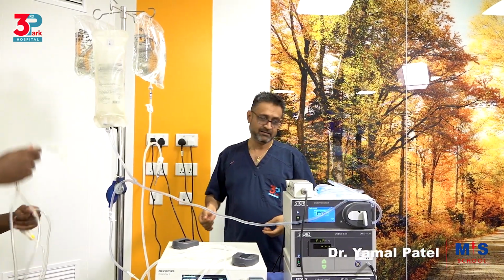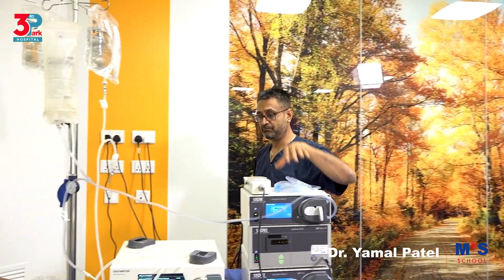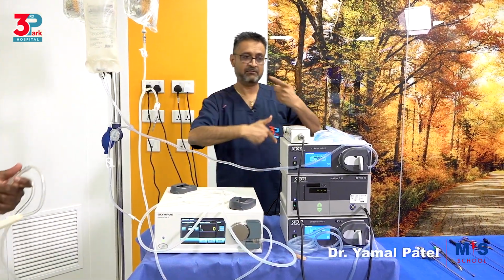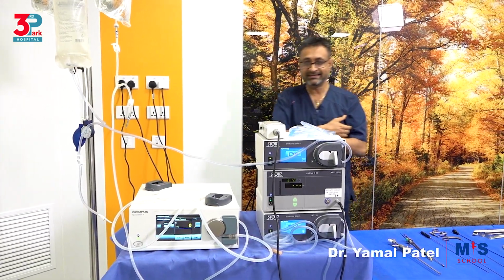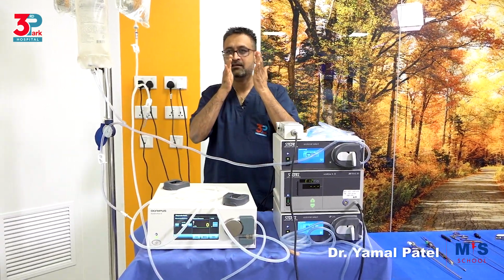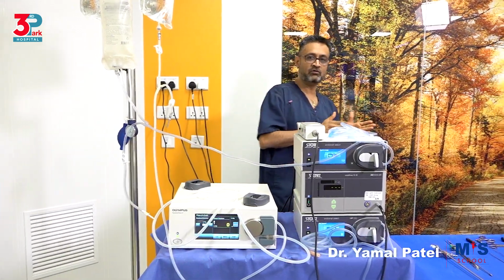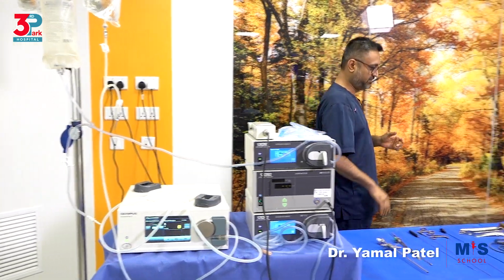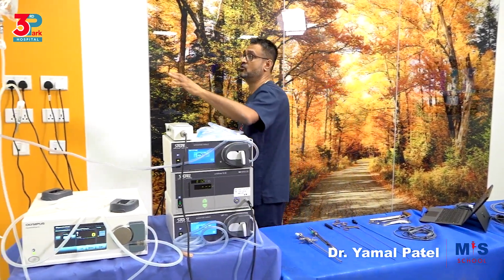without air entering into the tubing. The second type of tubings would be the ones that are specifically for these pumps. You have seen how they connect to the pump, and then the pump will control the pressure and the flow to maintain the environment of constant pressure, variable flow, continuous flow hysteroscopy system. So we have then normal saline.